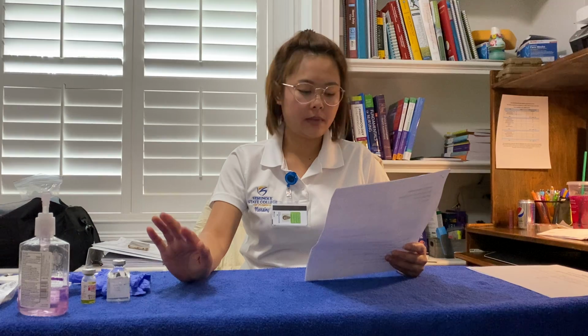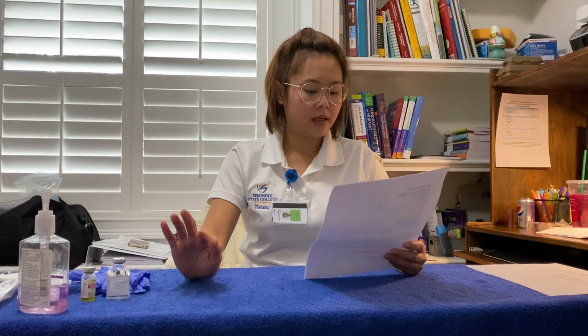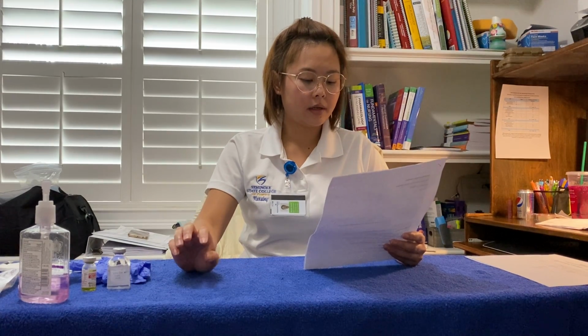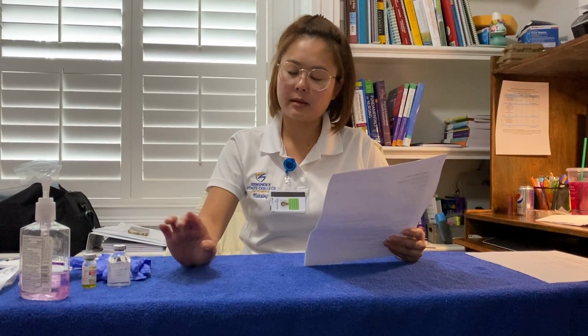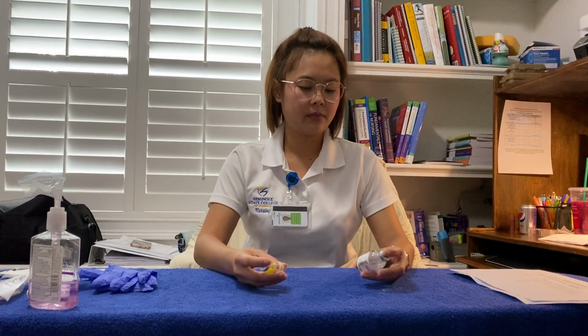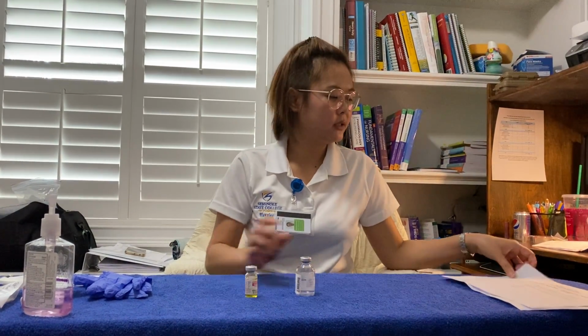Okay, I have Anna Pawlowski and B12 500 micrograms sub-Q, and then I give it once a month. The time is now. Okay, my doctor's order and MAR are matched, which is good. And then I'm going to retrieve my medication. This is when I'm going to do my first check for my medication.